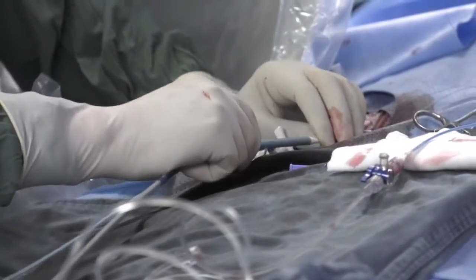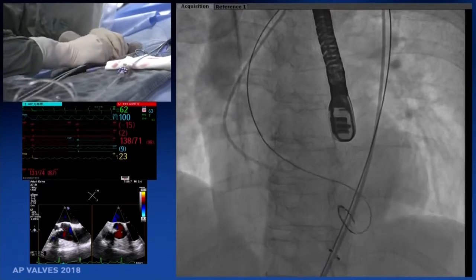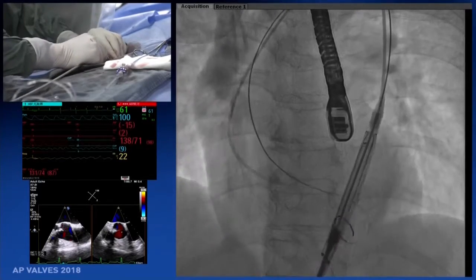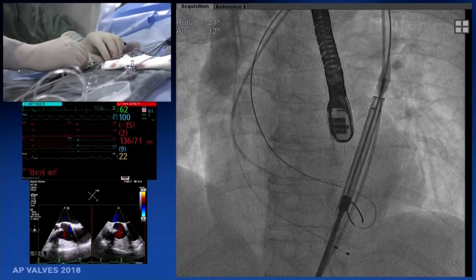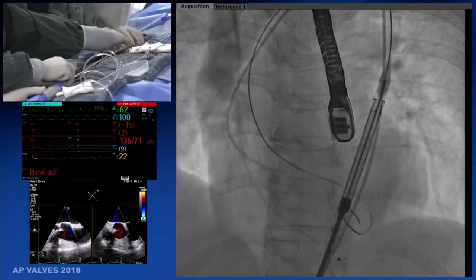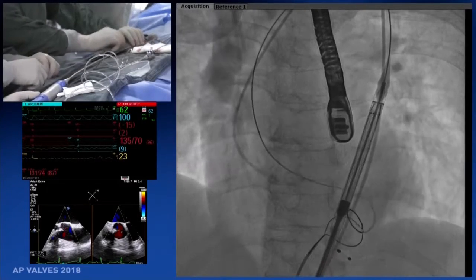The big challenge is that the left ventricular chamber is very small, so it's not good for supporting the device. We gradually advance the device. Can you see the full device in the descending aorta? Should we use the snare together, or just leave the snare here as a backup? What is your idea? Or we try the device in without the snare, with just a snare backup.